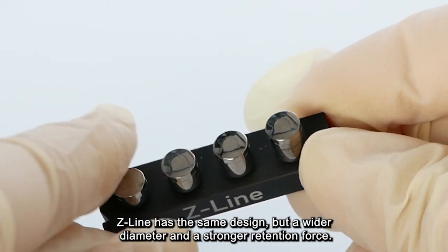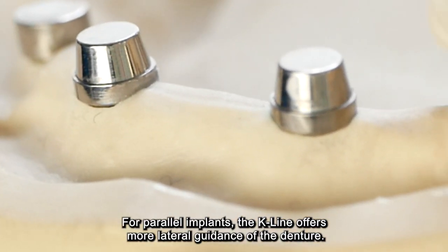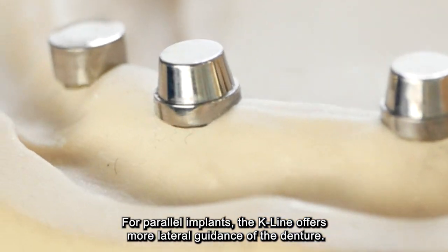The Z-Line has the same design, but a wider diameter and a stronger retention force. For parallel implants, the K-Line offers more lateral guidance of the denture.